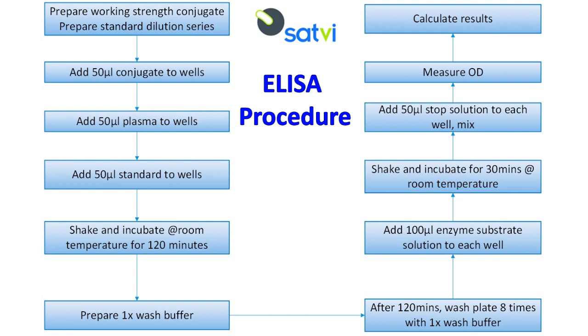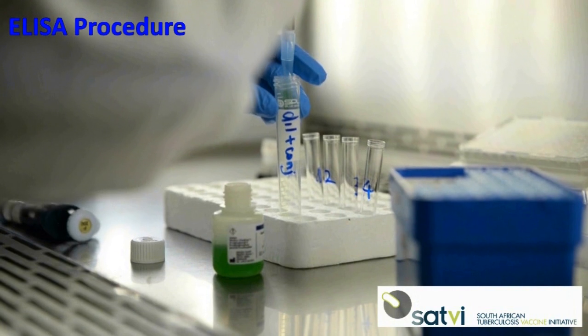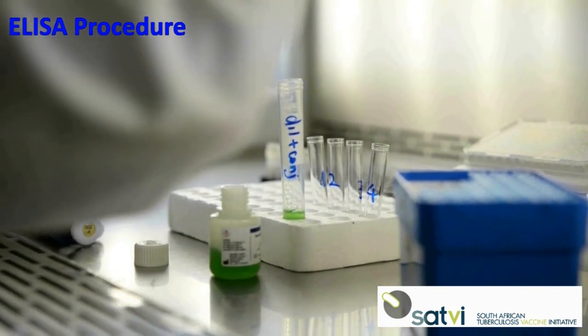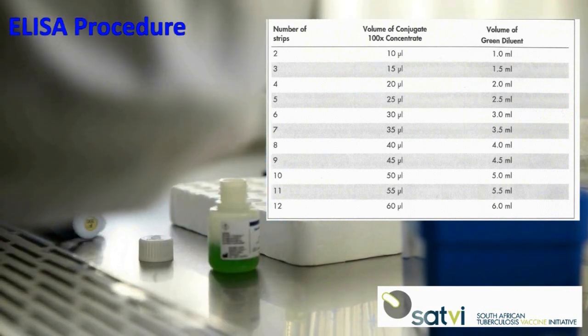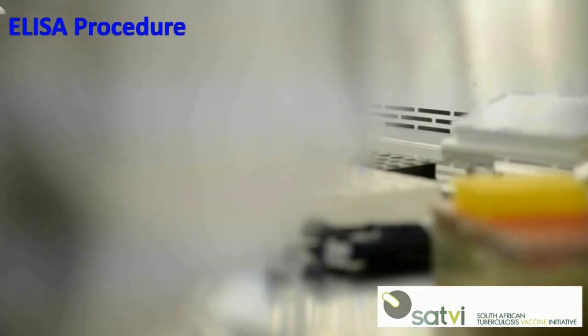A spectrophotometer is used to measure the ODs. Prepare the working strength conjugate by diluting the required amount of reconstituted 100 times concentrate conjugate in green diluent. Table 1 summarizes the volume of conjugate and green diluent needed for the number of strips required to complete the run. Return any unused conjugate 100 times concentrate to 2 to 8 degrees after use.